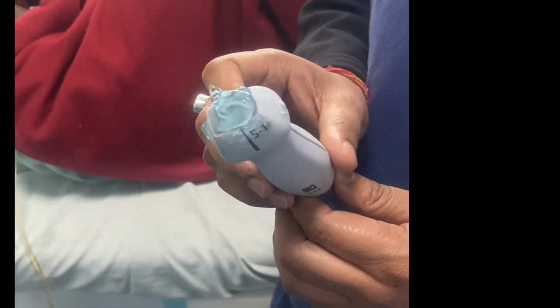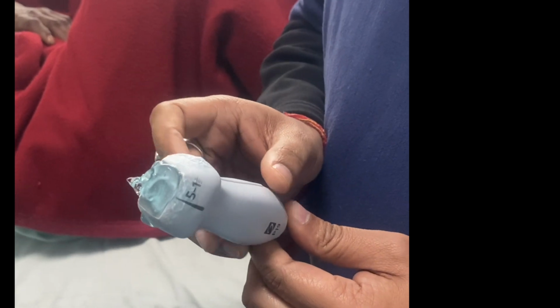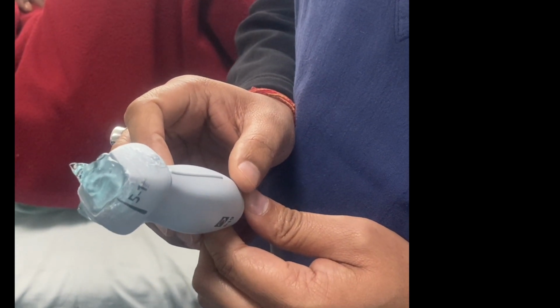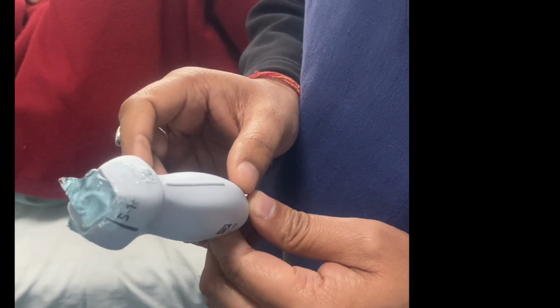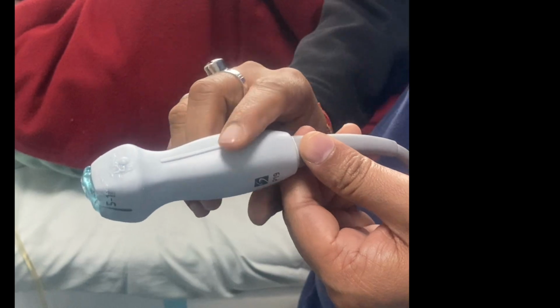For the parasternal short axis view, you have to keep this phased array probe into the third or fourth intercostal space on the left side of the sternum, and this orientation marker should be toward the left shoulder.